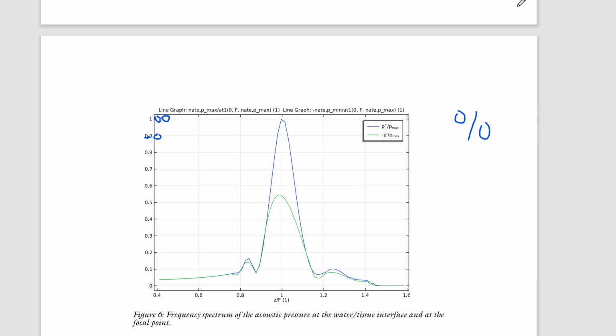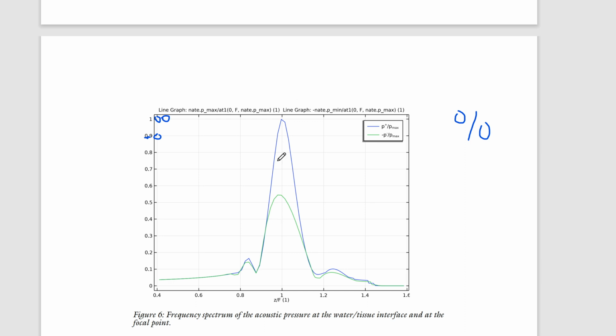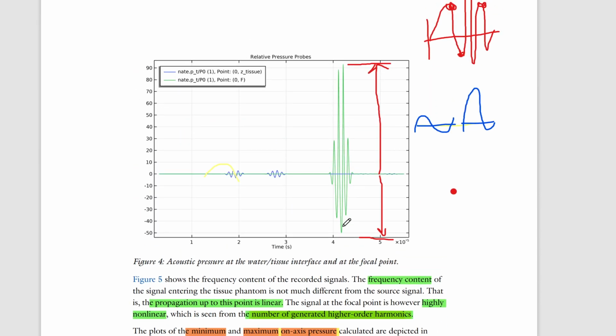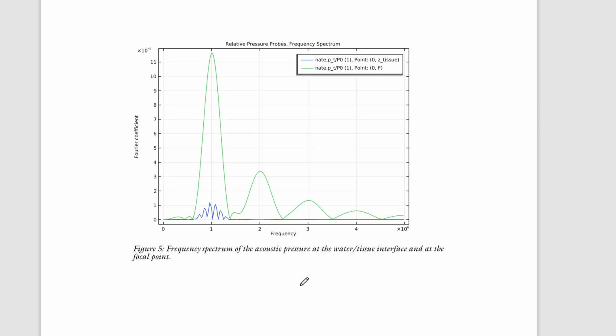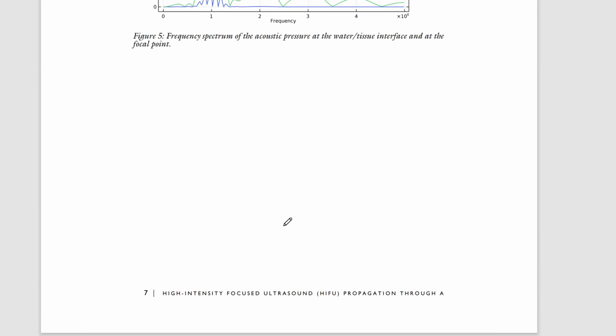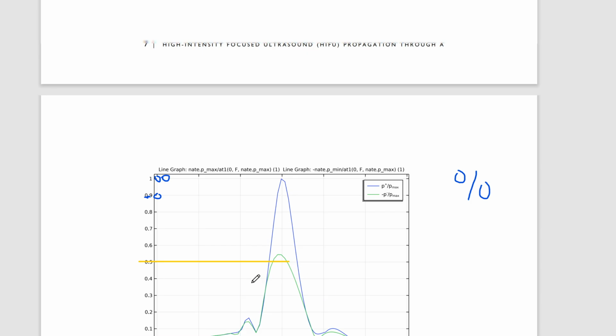So we were saying, let's test this here. We were saying that the maximum of this guy is about half of this guy. Let's see. 0.5. So our maximum of our lowest point is approximately half of our highest one, which we saw about here. So we can confirm that. Does it hold true for these? I went down too far. Does it hold true for these? And, you know, these are their ratios of this. Can't tell.